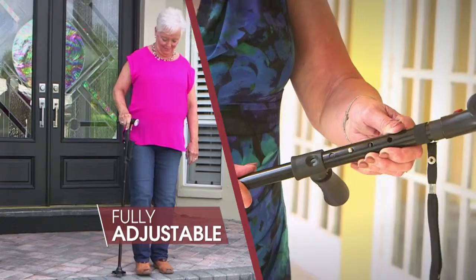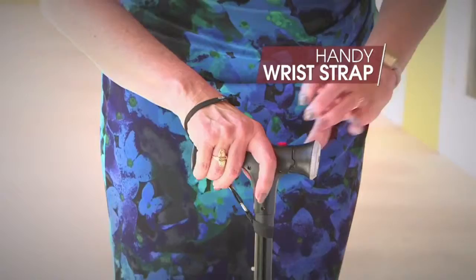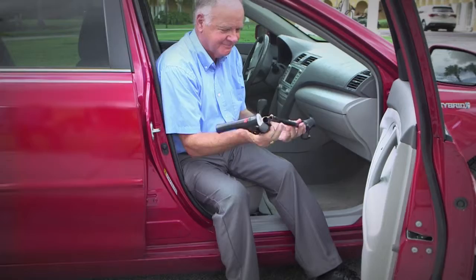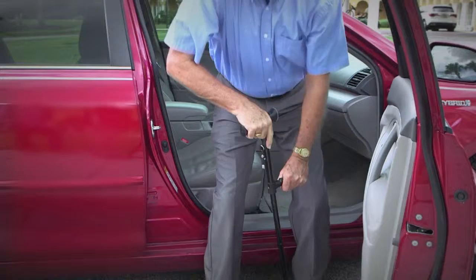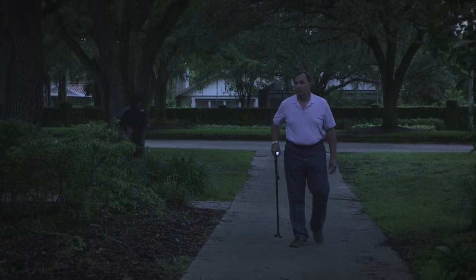The Clever Cane is fully adjustable with five height settings extending from 86 centimeters to 96 centimeters. Just click the extend pole until it locks in place for your perfect custom cane. It has easy grip handles and a handy wrist strap for added security. The Clever Cane folds up for easy storage so it goes where you go. Simply unfold — the cane securely locks itself in place and you can get in and out of your car with ease.